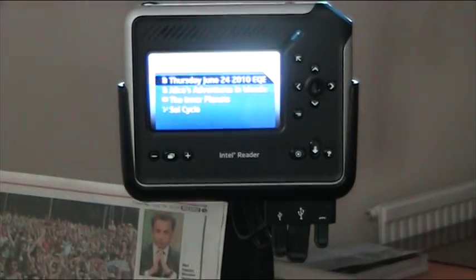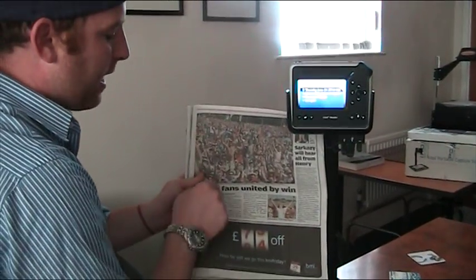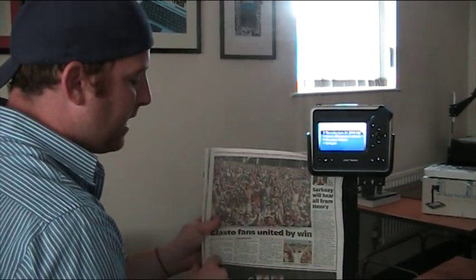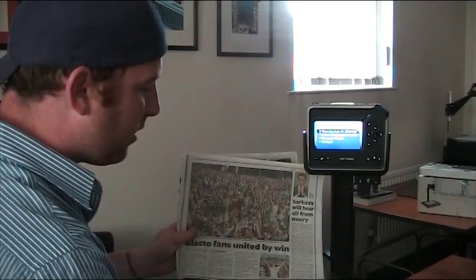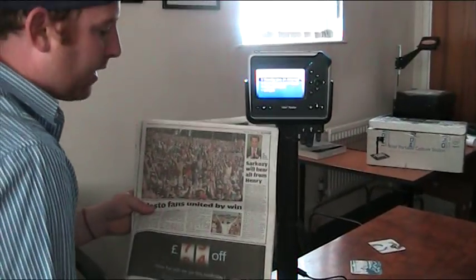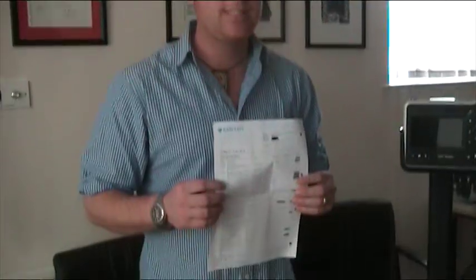They did a good job recognizing it — there was like one or two mistakes, but not really a whole lot. Overall, not bad. It actually recognized the different margins and different places where the print was, and it read down per paragraph. After it was done with this section, it actually skipped right on over to go on about Sarkozy. So it can do general print pretty well — you can stick a newspaper inside there and have it read back to you. Now let's see how it holds up against something you get in the mail every month: your bank statement.